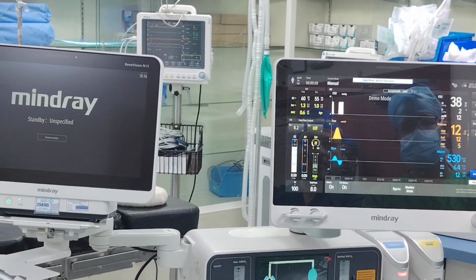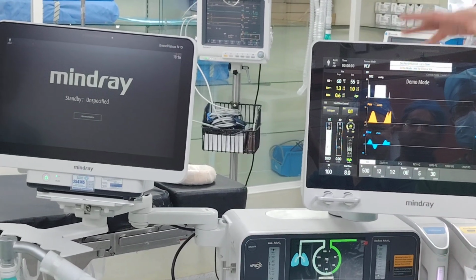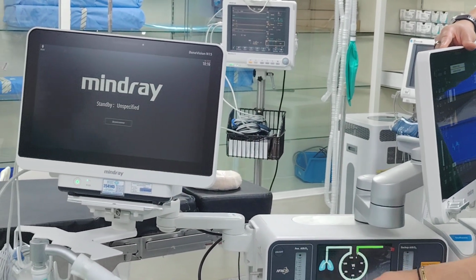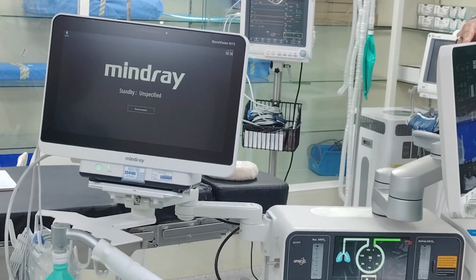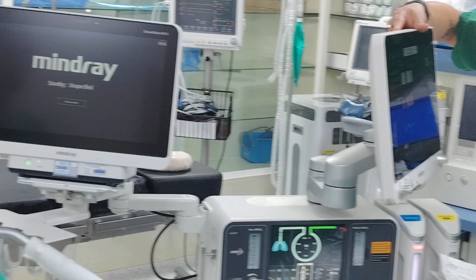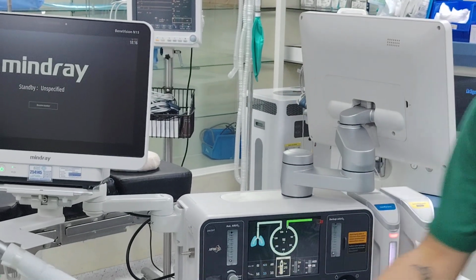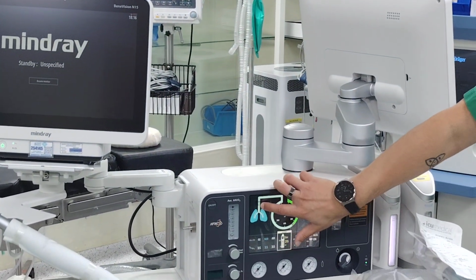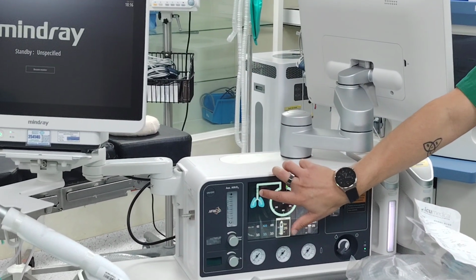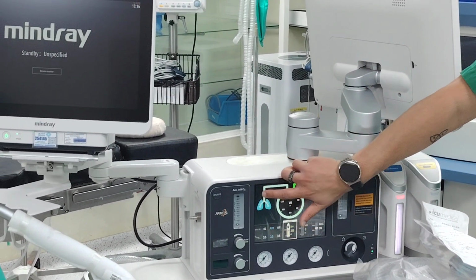So now we have the tube, you go to automatic, correct? Automatic, you will have here the picture change. The green represents the volume it is giving. Today, if you have a leak, for example, the leak will show you here. But what if my screen is like this and you're working with the patient like that? You can look here. Here it will show you leak and disconnect. So remember, whenever there's a leak, whenever disconnect, this screen will also show you from here.